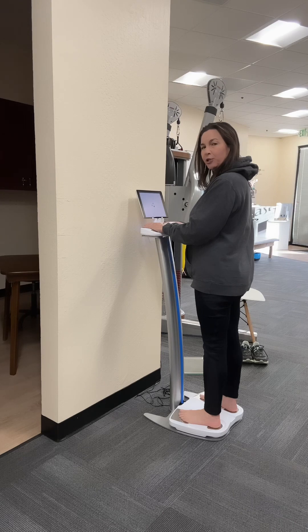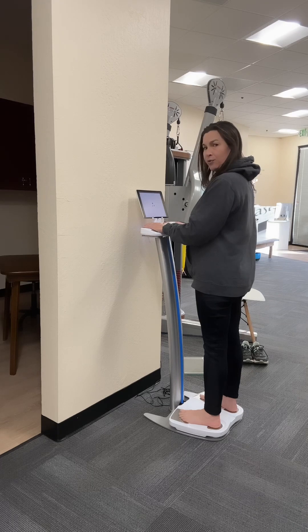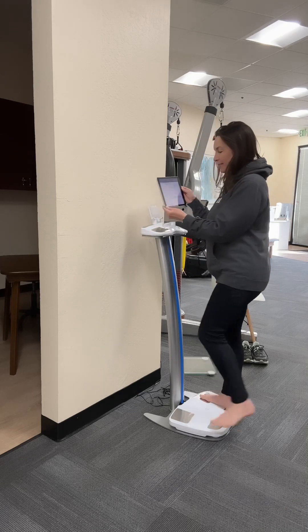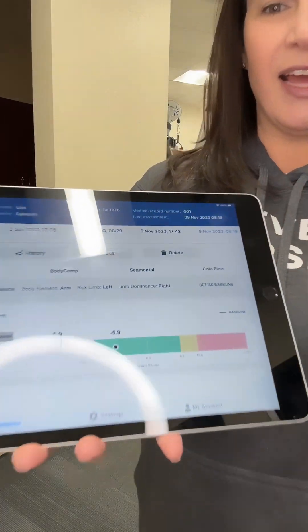If you're quiet you can hear a little bit of clicking. That lets us know that the device is in fact working. It takes about 30 seconds for the reading — and here we have it. So I can step off of the device and we're going to go through and look at everything now.